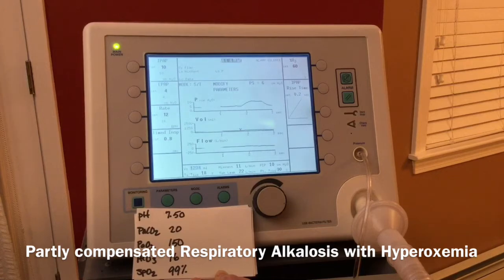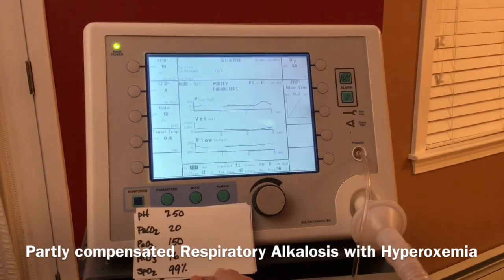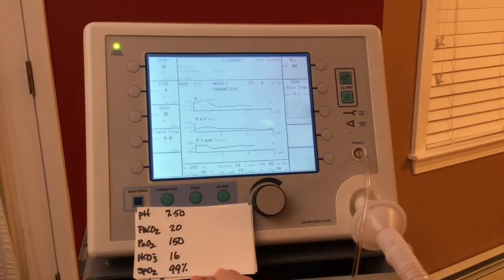Identify if this is a ventilation or an oxygenation problem. Pause the video. If you stated this was a ventilation and an oxygenation problem, you were correct. Which parameters would you change to correct the blood gas? Pause the video.